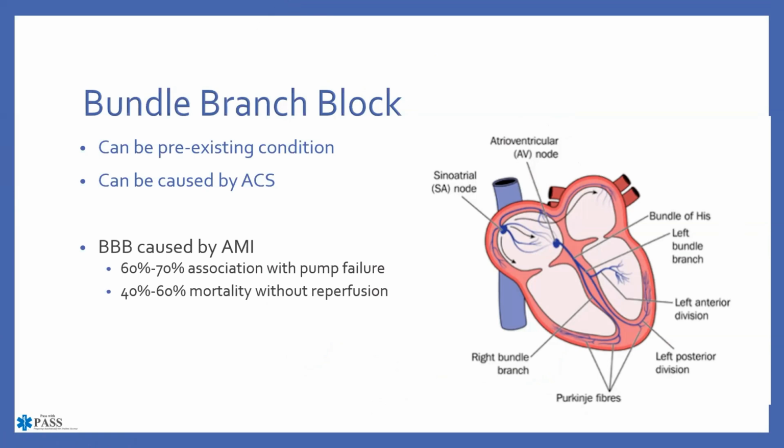Where the problem comes in is a right bundle branch block. We can still read our EKG under normal conditions. So if you do an EKG and you think that your person has a right bundle branch block, you can still feel confident in calling in and telling the doc that you have a patient that's having a STEMI, for instance. If it is a left bundle branch block, you need to be a little bit more reserved on that.